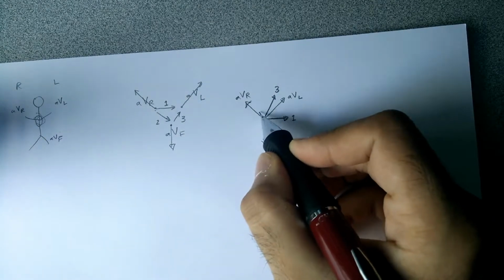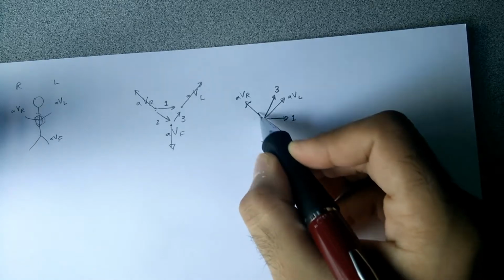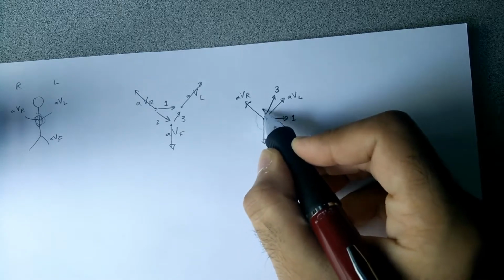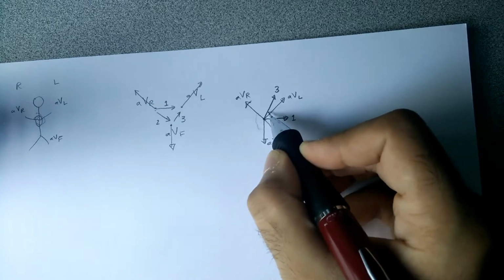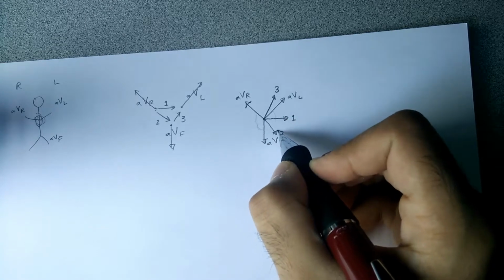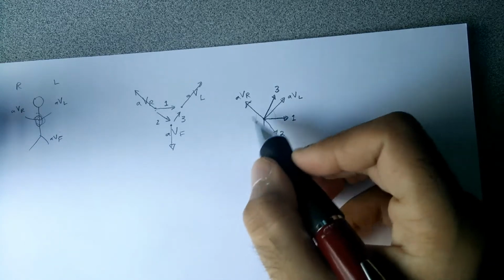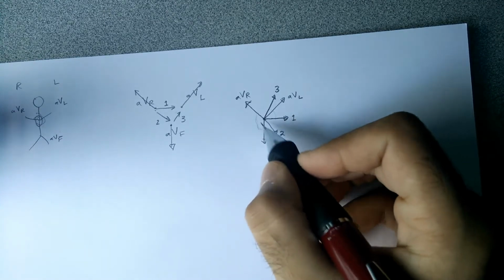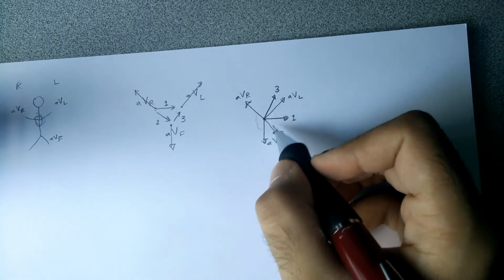We'll have our heart drawn here on top of this. Our left ventricle is going to sit down here, right atrium's up here, right ventricle's here, left atrium's here. Depending on where we have pathology, either myocardial infarction or pericarditis, we can determine where we'll see ST changes based on the leads.